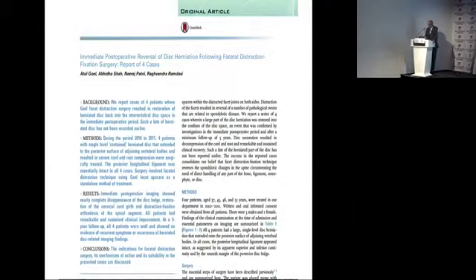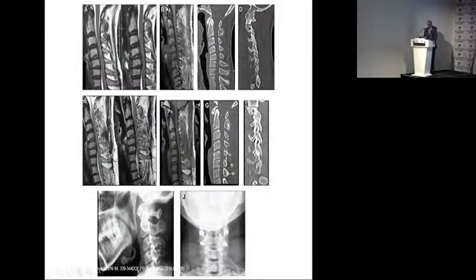Disc prolapse, okay? Distract the facet, and you see the immediate postoperative reversal of disc herniation following facetal distraction. So this I reported in World Neurosurgery, and this is the scan which is showing preoperative, and unfortunately, let me put my glasses.